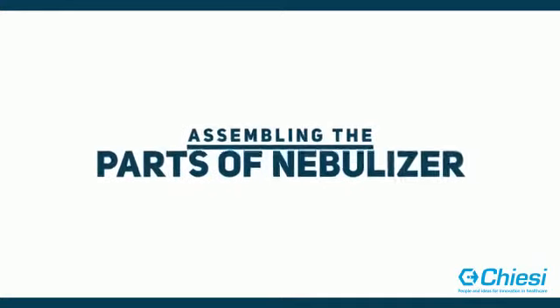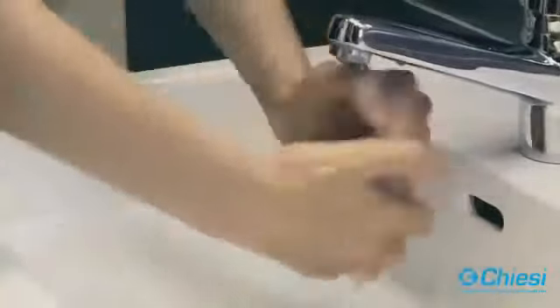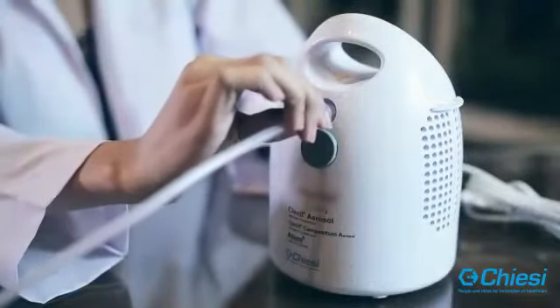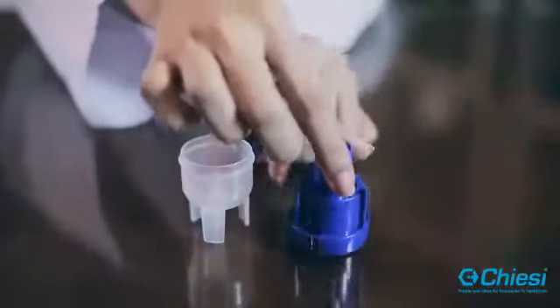How to assemble the nebulizer parts. Wash your hands prior to nebulizing. Place the compressor on a smooth surface. Connect one end of the air tubing with the compressor air outlet. Open the cap of the medicine chamber.